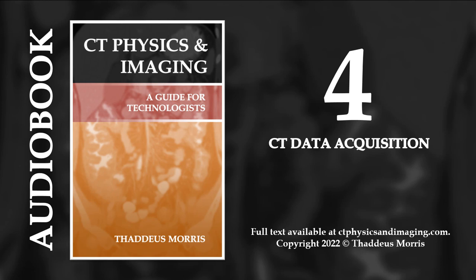Volume scanning. The only scanning mode requiring no table movement is volume scanning. This is only possible with scanners using a large number of detector rows, 250 or more.